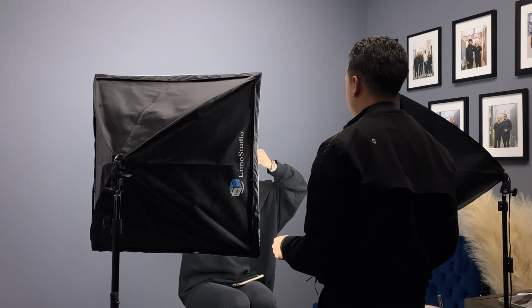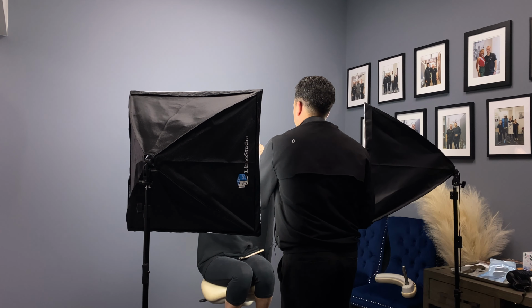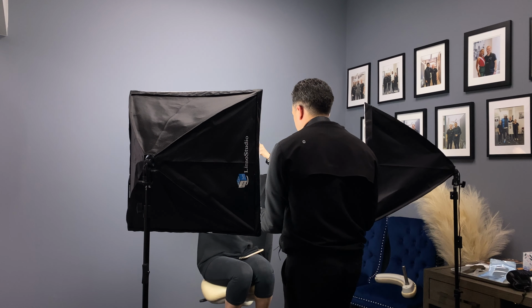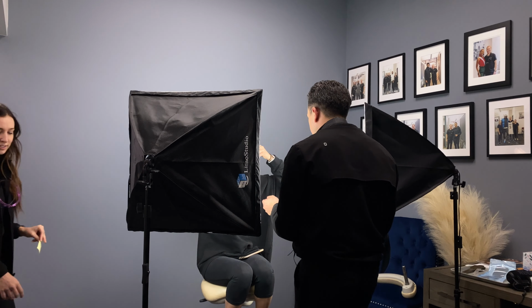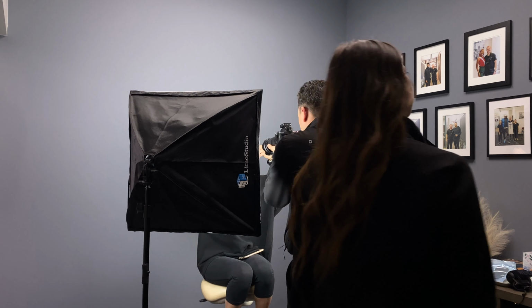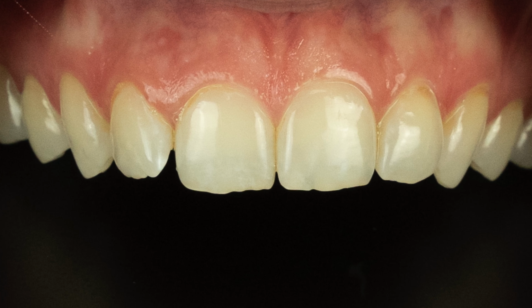So I'm having her do that. And I'm actually doing the contrast shot right here. And I think I do the regular just cheek retractor set after this. But what I'm having her do is hold the cheek retractors at 45 degrees on up. Okay, and then I'm basically resting the contrasting plate on her bottom jaw, and I'm just having her basically hold her head there, and I take the shot and I'm done, and that's it.